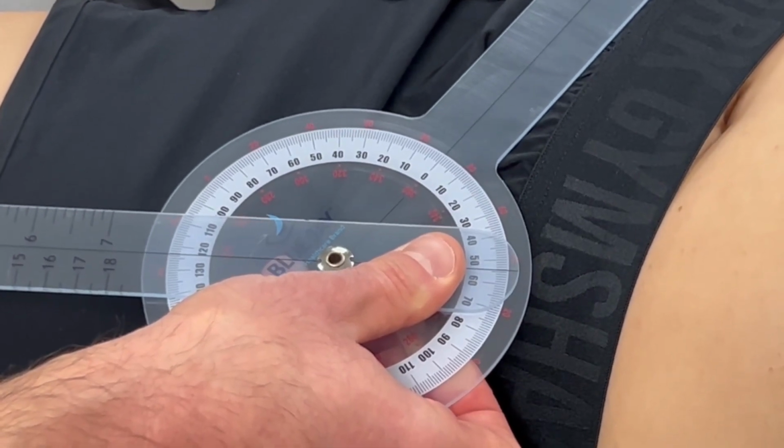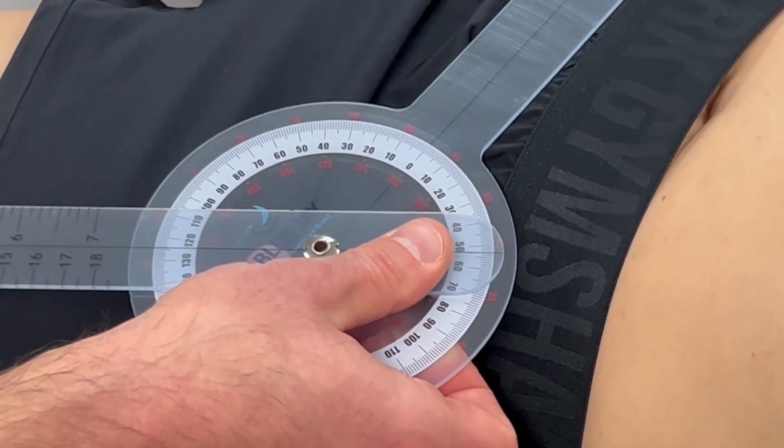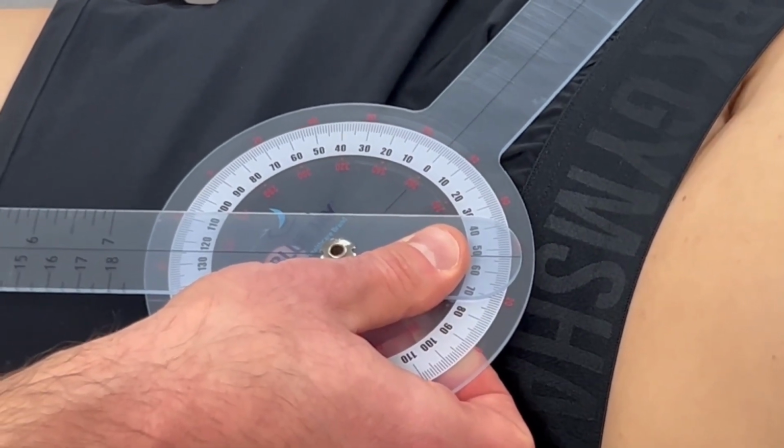Another example is ankle dorsiflexion. When we start at that perpendicular position, then we're going to use the red dial on the goniometer for our measurement.